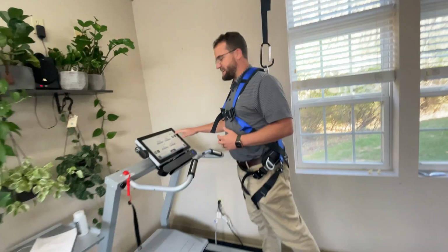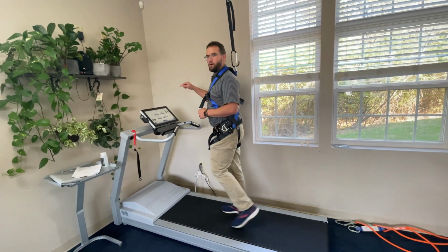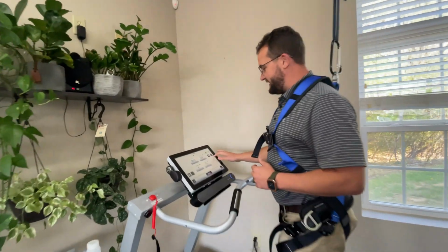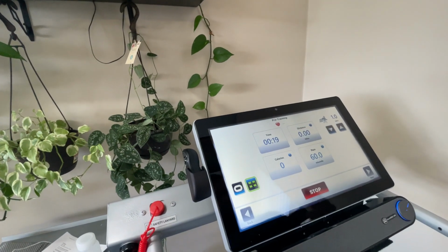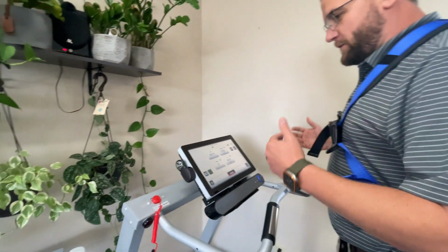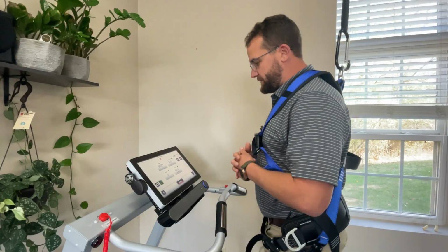And the nice thing is this actually goes in 0.1 speed increments. So you can go 0.1, 0.2, 0.3, etc. So you can help to lock in a great pace. We're going to just do 1 mile an hour for today, getting used to the settings. Again, the patient might take a few minutes to get adjusted and acclimated. That's great. That's what this pre-training is for.